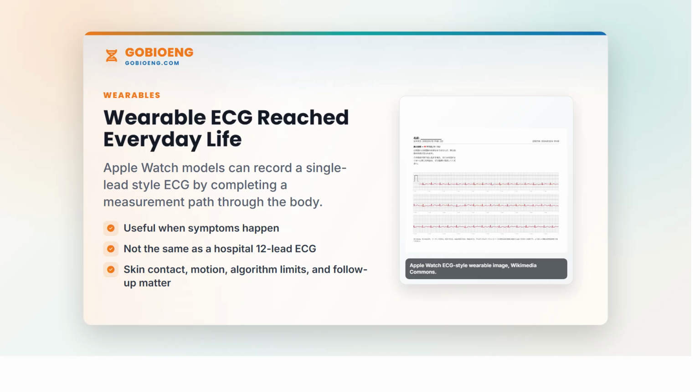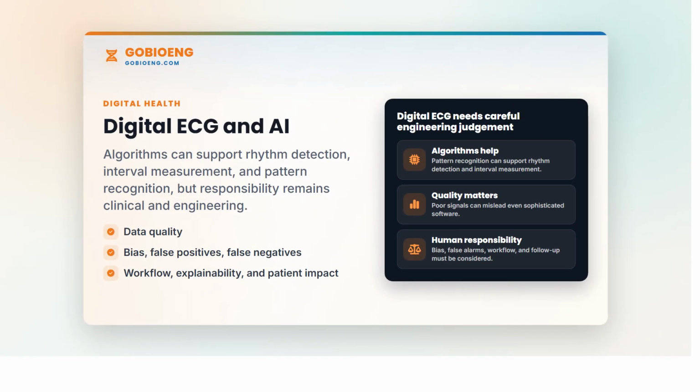The future of ECG is not just smaller hardware. It is better context. A useful future ECG device may combine rhythm data with symptoms, activity, sleep, medication timing, oxygen saturation, blood pressure, and clinical records. The engineering challenge is to collect helpful data without creating noise, anxiety, or unnecessary clinical workload.